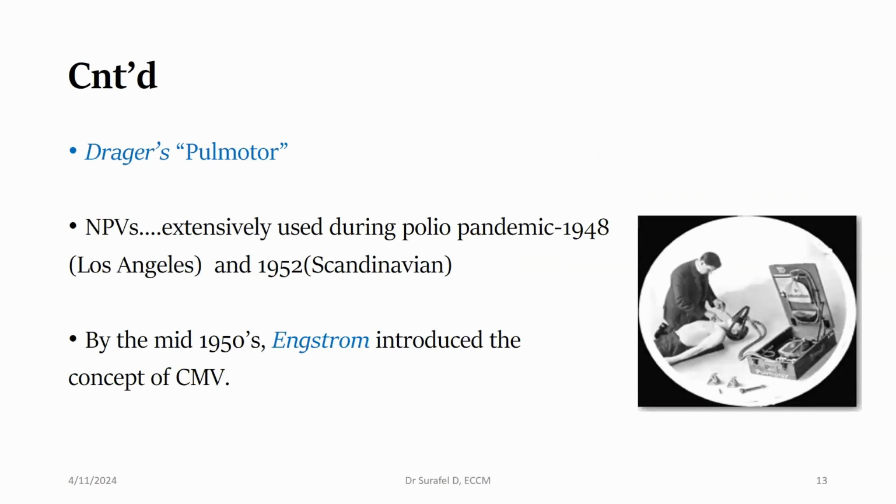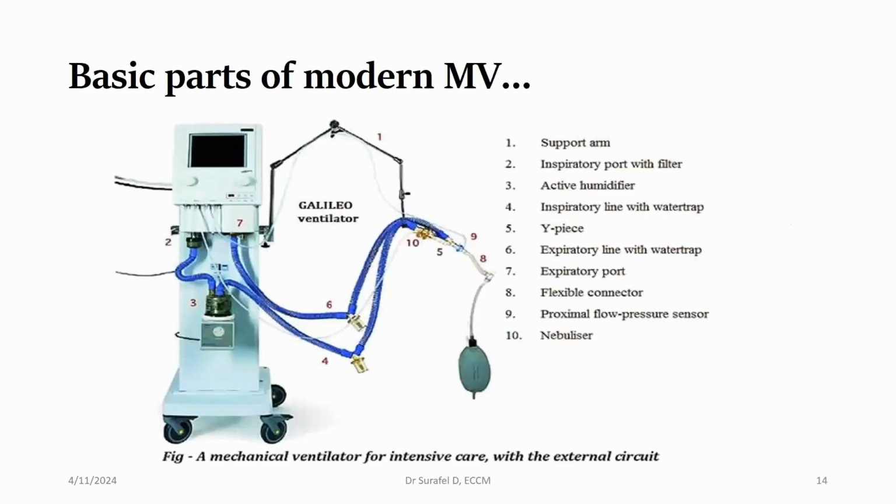It was not until the mid-1950s or 1940s that the idea of positive pressure ventilation started; before that, scientists were using negative pressure ventilation to ventilate patients. So this is what you see.